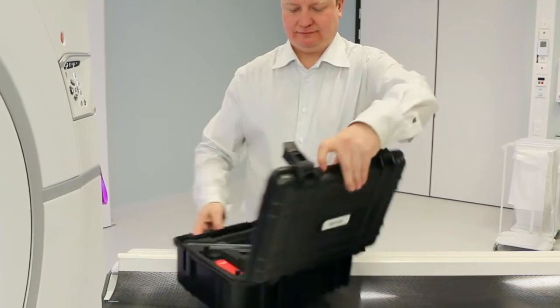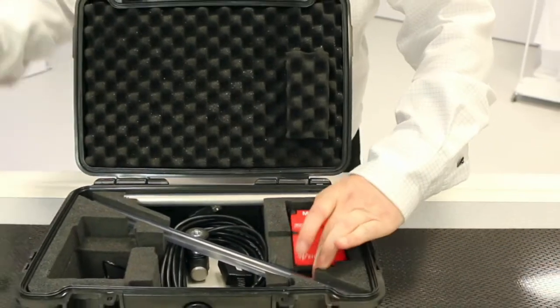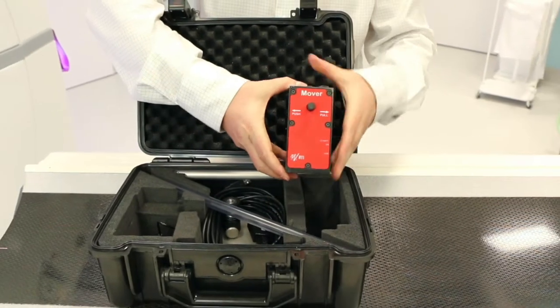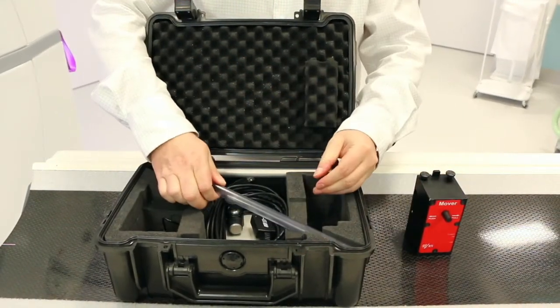We start by showing how to assemble the mover. The mover kit contains the following parts. The mover itself. Plastic tube to protect the user from the wire.